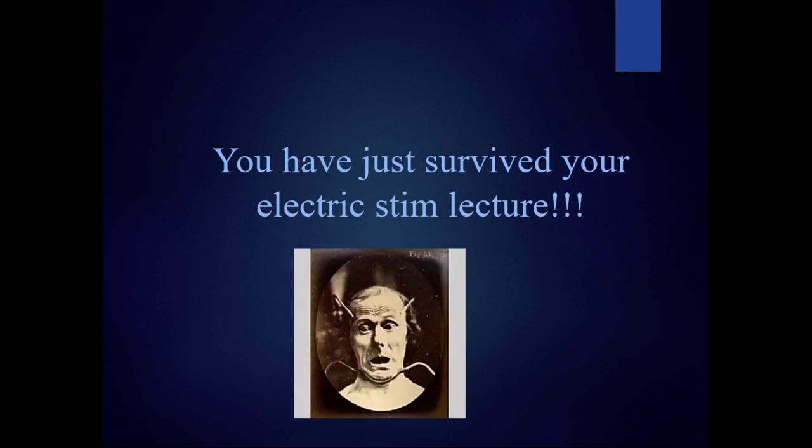The one thing I'm going to talk about is integration. When we're trying to figure out what modalities to use, or what Stim modality to use in particular, what is our goal of treatment? How is this going to affect tissue healing or pain or motion restrictions or muscle tone? That's what we want to ask ourselves. We want to check on the contraindications and precautions. Is the modality safe? If it's not safe for the person, we're not going to even consider using it.